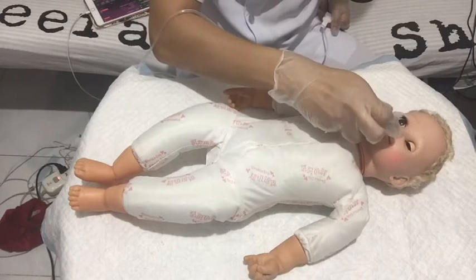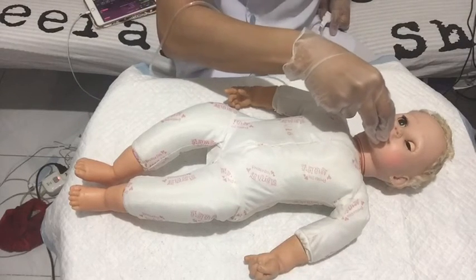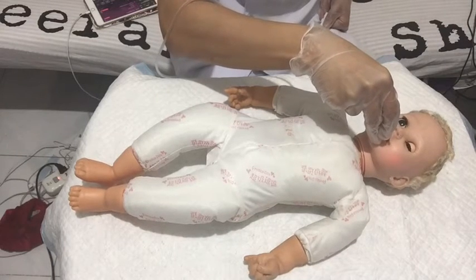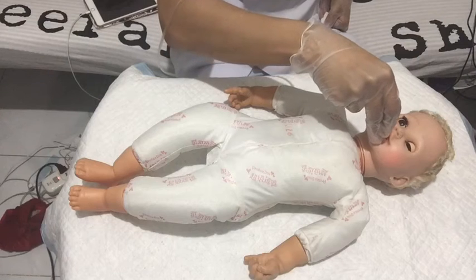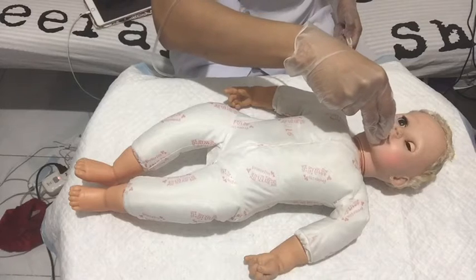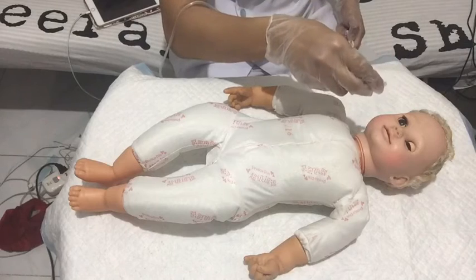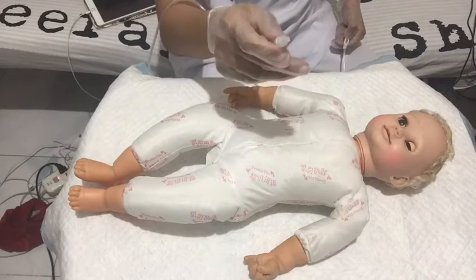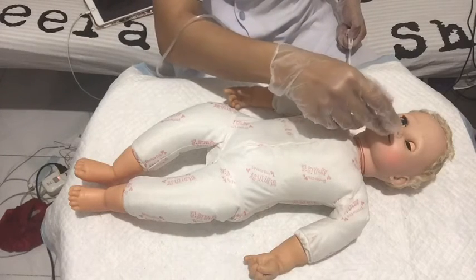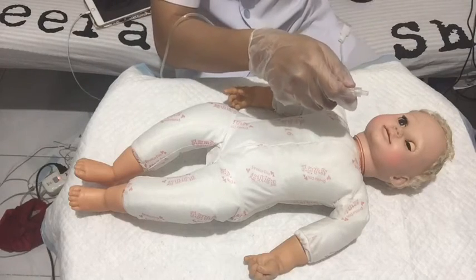We're going to open the baby's mouth, and feel our way until we can feel the pharynx and if there's resistance. Now we're going to apply intermittent suction with the catheter. Okay. Now we should remember that we shouldn't apply the suction for longer than 10 to 15 seconds, because the possibility of the suction sucking out the oxygen is dangerous for the baby.